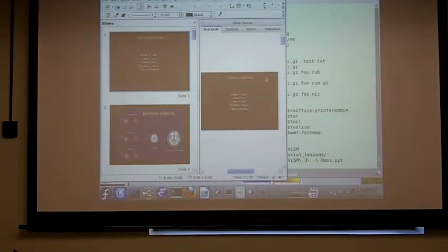So yeah, in Nifty files, there is a space in the header for affine transformations. And there's actually 3 different ways to store orientation in Nifty files, and every software package supports a different subset of those 3. So although it was supposed to make things easier, I think in many ways it's made things more complicated. But what's worse is that the Nifty file header only has a way for storing 1 image's worth of orientation information. So if you have a 4D file that has 100 different 3D images, it can't store all the transformations in the header that way. So you'll typically then still have to create an external file with the transformation information.